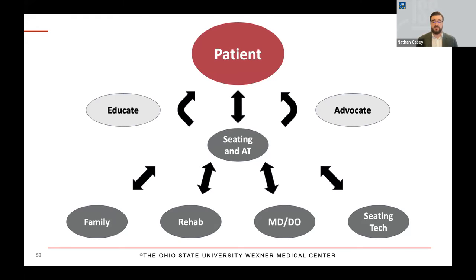I think depending on our role, we have the potential to utilize this data to improve and translate to seated outcomes. If you're a therapist and you notice your patient has poor trunk control or has persistent trunk spasticity that limits their functional capacity from the chair or frequently causes them to be mispositioned, trial STIM. If you're a vendor or a tech and you notice that these things are persistent problems with the patients or clients that you're working with, consider helping them get or educating them to try and get a referral to therapy. If you're an educator, discuss these concepts with your students. And then lastly, if you're a family member or somebody that utilizes wheeled mobility, advocate or question the use of this technology when you're at therapy sessions. Electrical stimulation can be applied in a wide range of situations and have positive outcomes.